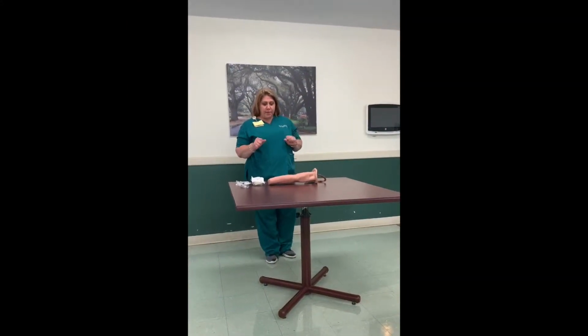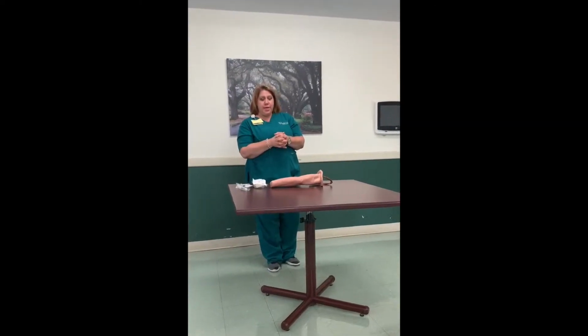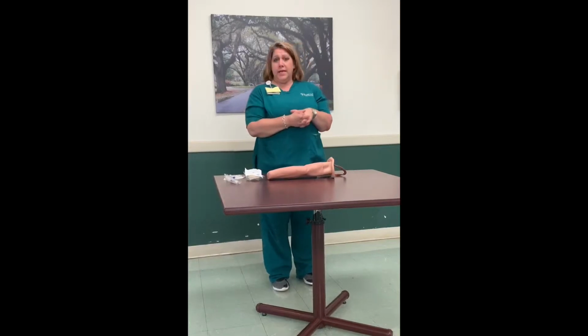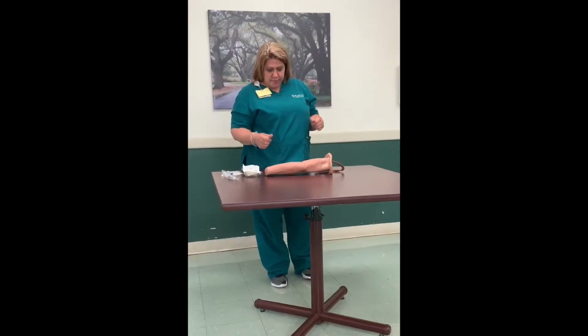And I'm going to show you my audience. There's Ruby and Norma. Okay, so this is my demonstration speech. I'm going to show y'all how to insert an IV. I'm a nurse here at Croy Health in Aiken. You can see I'm dressed in uniform.